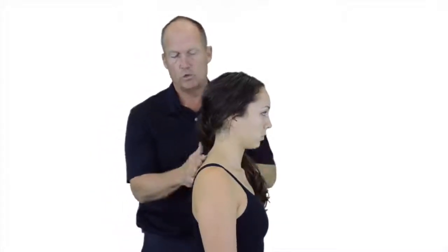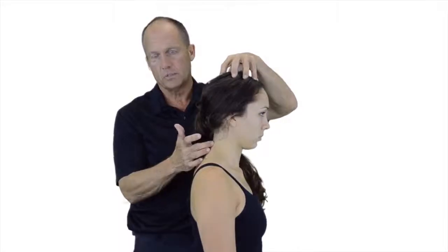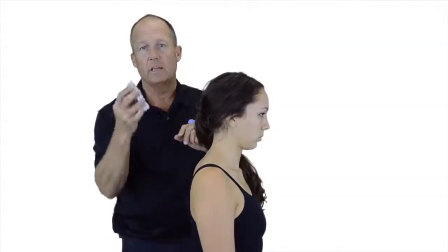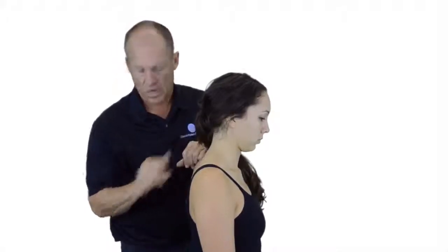With the patient in a neutral sitting position, we're going to measure for cervical flexion of the spine utilizing our inclinometers. Our landmarks, in this case, are going to be the T1 spinous process.